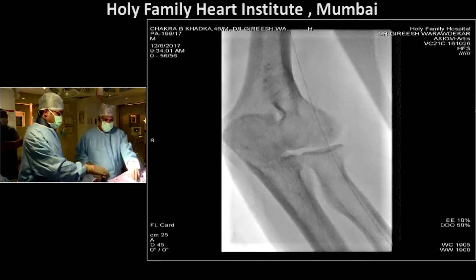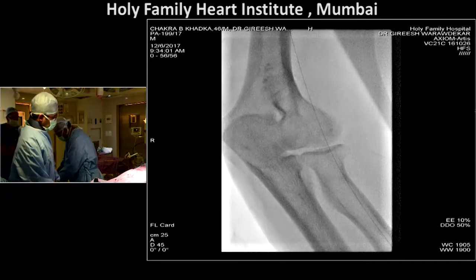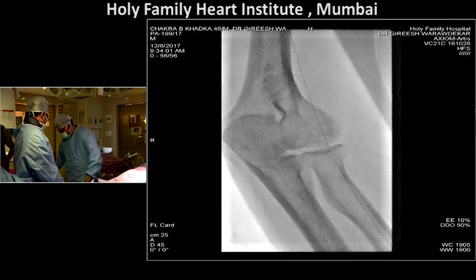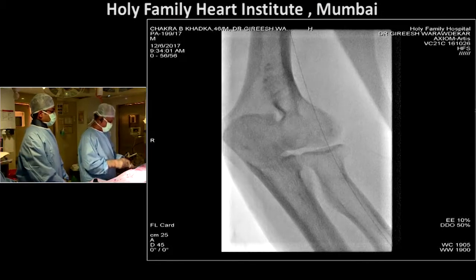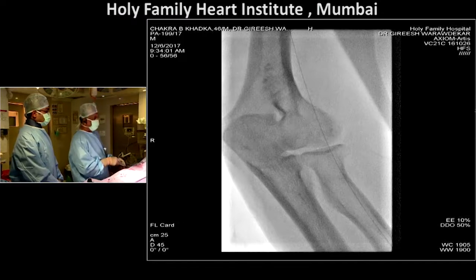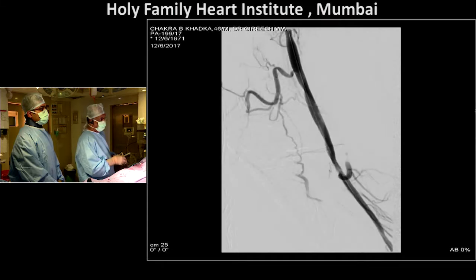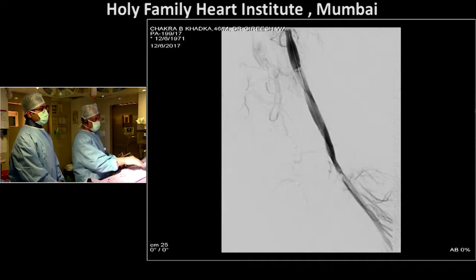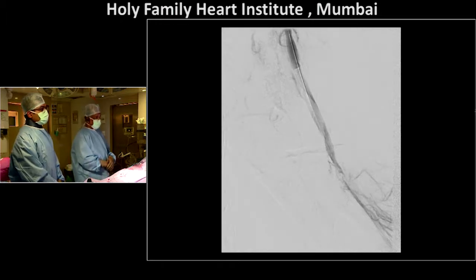We still do not have real answers, but I think I would have left the patient on a little long-term low molecular weight heparin or something, so that you don't have an acute thrombus in the next 10 to 12 days. And with that background, I think each patient should have done well. Yeah, a little spasm again at the distal end, which needs attention, which is what will happen with these kind of balloons again and again.